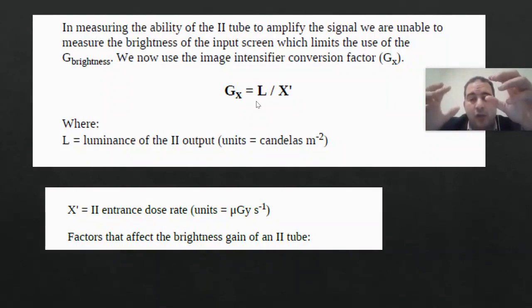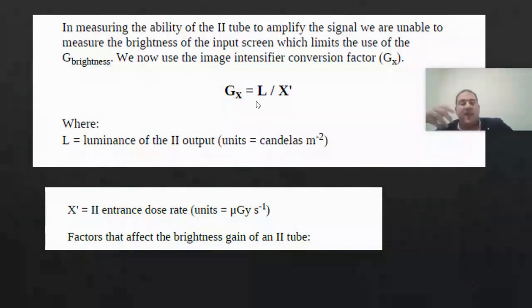The dose is always measured in gray, which gives you information about the dose, as we will discuss later regarding effective dose, absorbed dose, and equivalent dose. These are all units you often hear about, like millisievert and milligray. You often hear the difference between milligray and millisievert. Millisievert always represents something called effective dose.